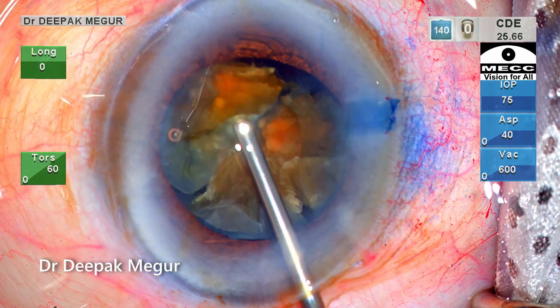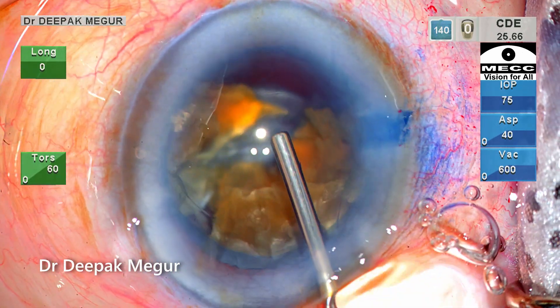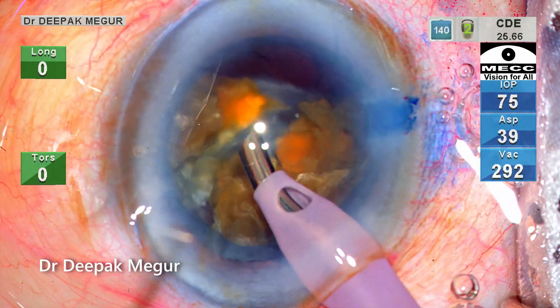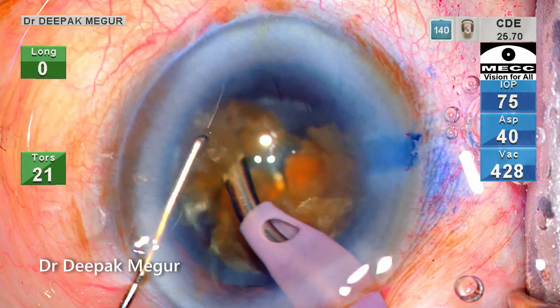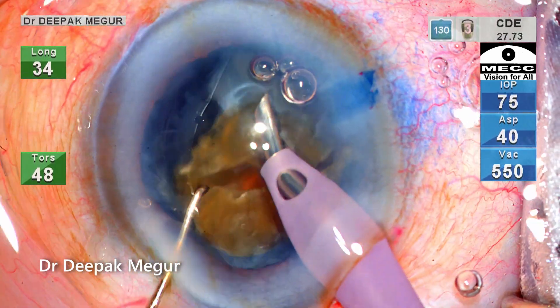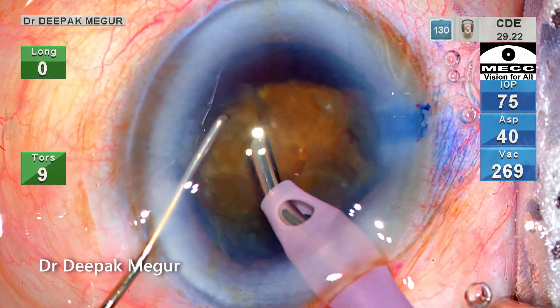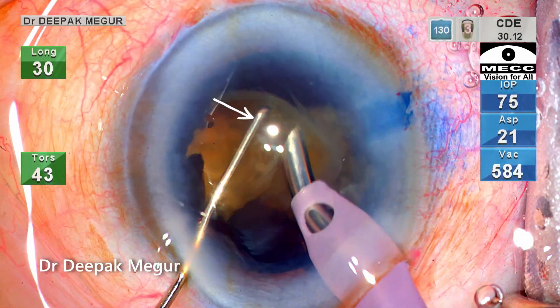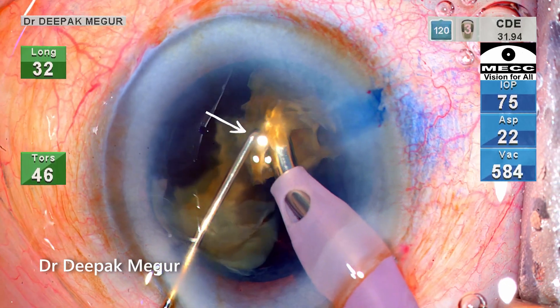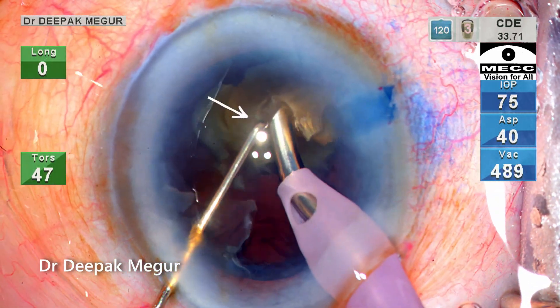The emulsification of the fragments is being done in a very controlled manner to minimize turbulence. OVD is being replenished — first I used a dispersive OVD which has sodium hyaluronate and chondroitin sulfate, followed by HPMC underneath it. The remaining fragments are emulsified similarly. My second instrument, which could be a chopper or a Sinskey hook, always acts like a guard and prevents smaller fragments from flying around and hitting the cornea. It is placed at or just above the level of the phaco tip and just beside it.